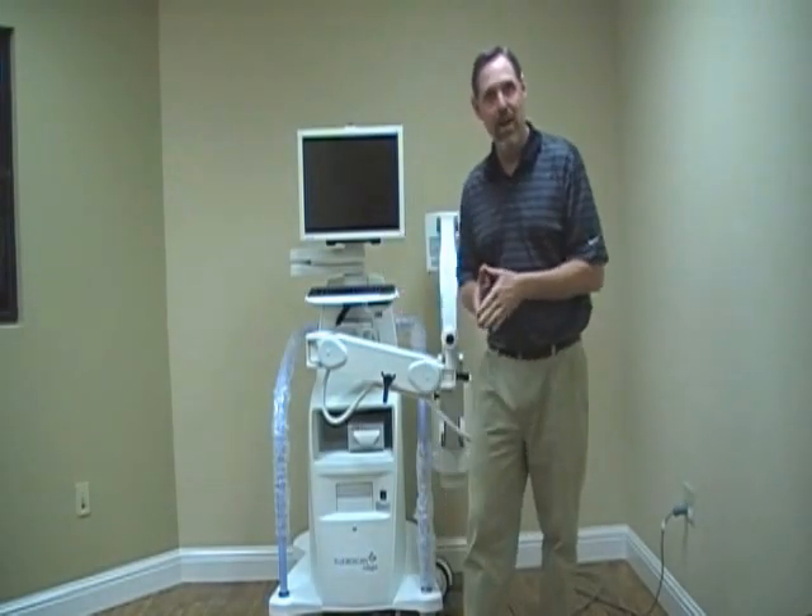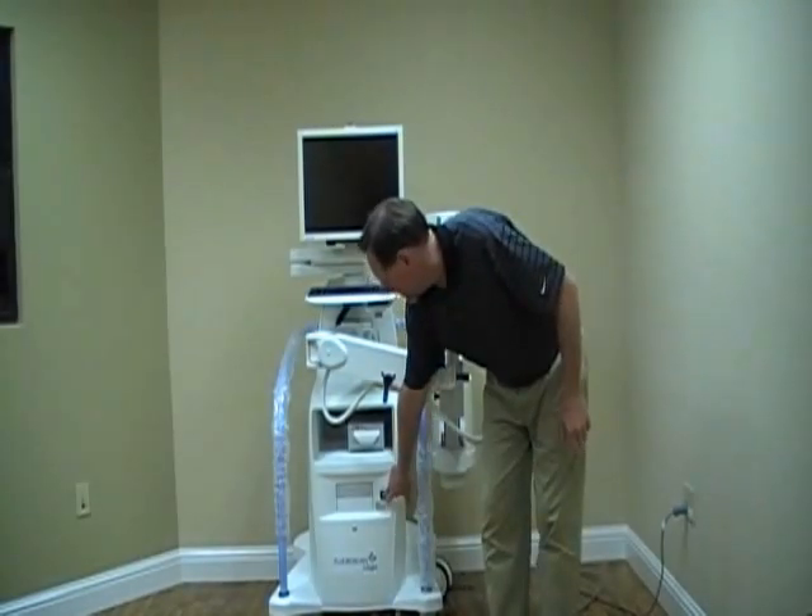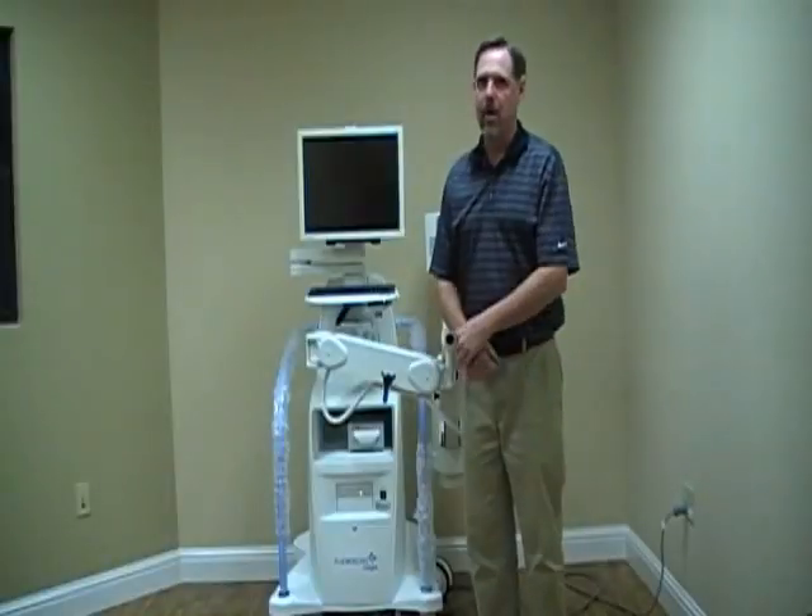This is FloraScan 101 — how to make it work. Using the on switch, turn the system on.